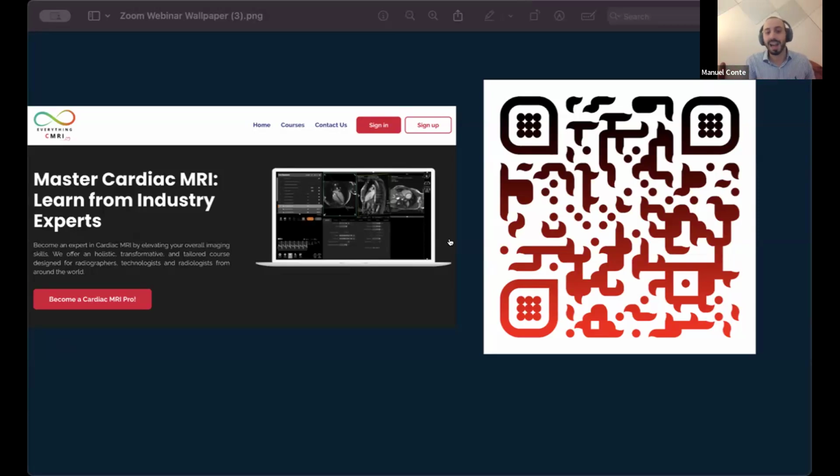We don't have to get high resolution images. We need to make the images diagnostic for that specific clinical indication. Yeah, you have to get an answer with the best that you can, right? With that artifact. As long as you get a diagnosis, that's what matters.